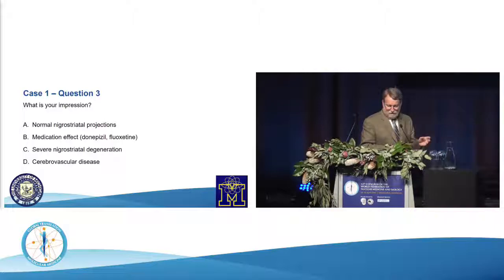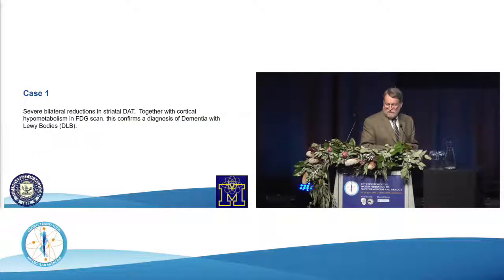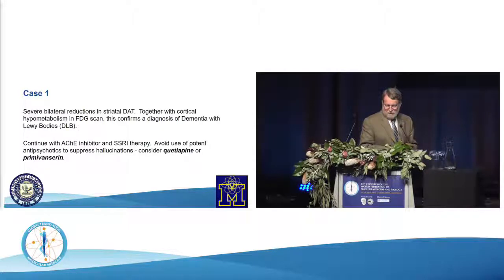And D, cerebrovascular disease. Well, it's not. So indeed, this is severely bilateral reduced DAT expression. And together with the FDG picture, this virtually confirms a probable diagnosis of dementia with Lewy bodies. And it has management-salient contribution here.